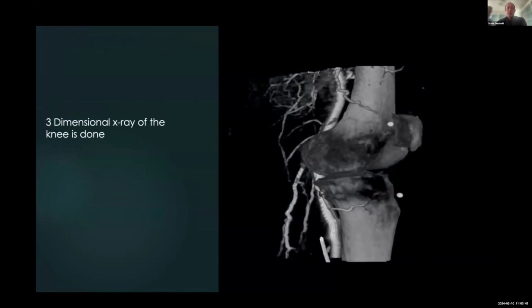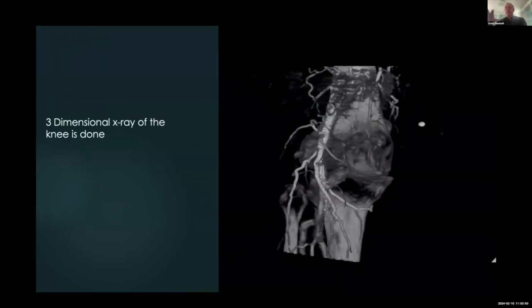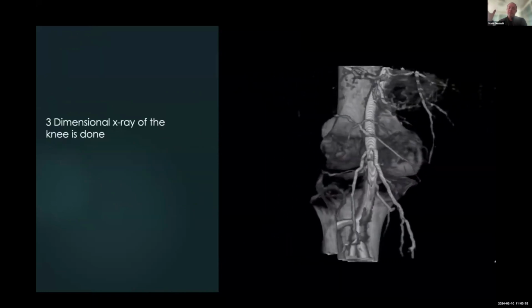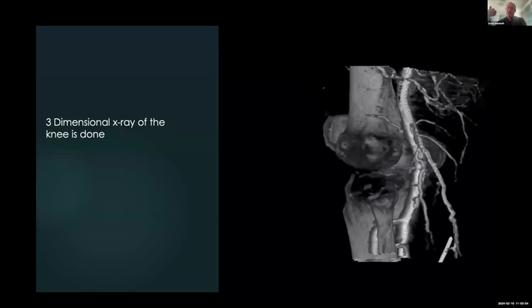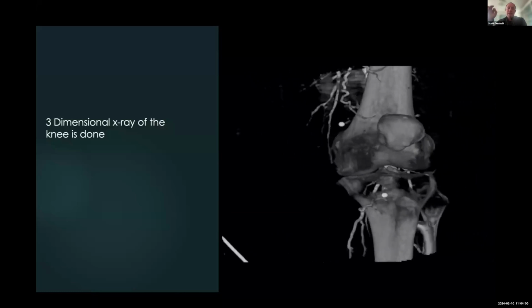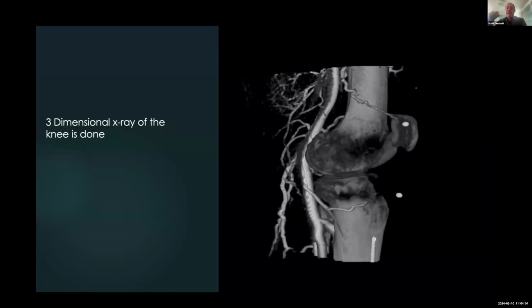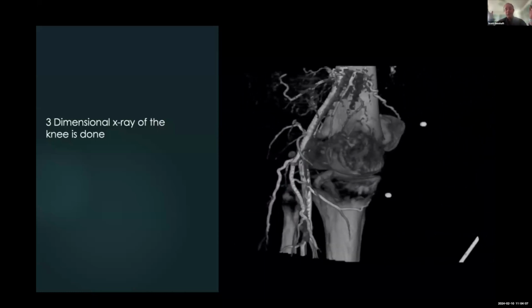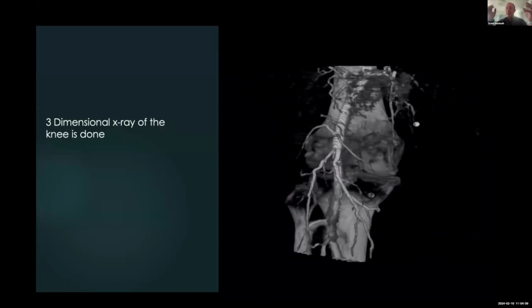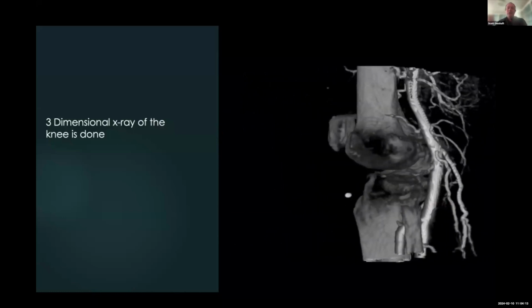In our practice, we also perform a cone beam CT. And this is really useful. This is not the set of images we typically use. We use these three-dimensional images to select the orientation the vessels are arising from to facilitate catheter selection. But what we specifically use them for is to identify the vessels that are going to the areas of pain in the patient's knee. Interestingly enough, when you start seeing these patients, a lot of them can really localize where they're feeling pain, and it's often medial.